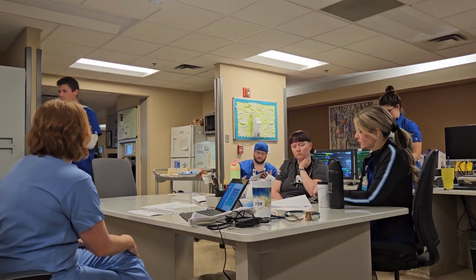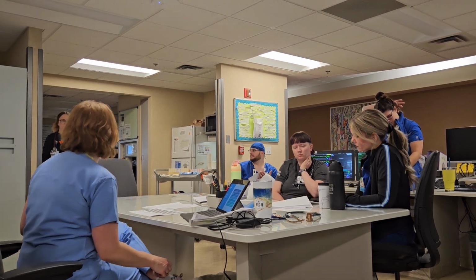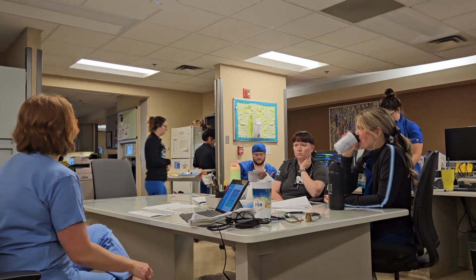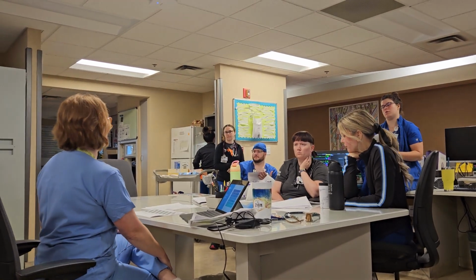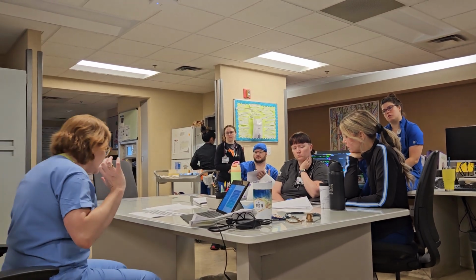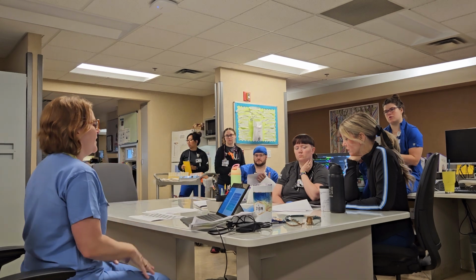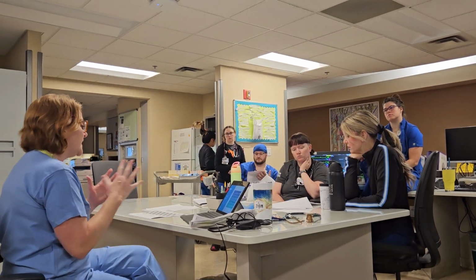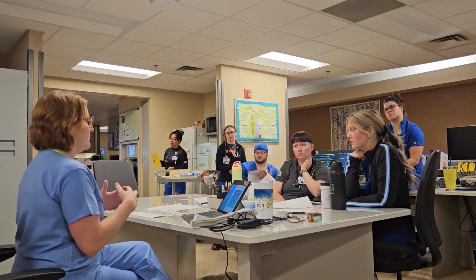Pressure support is neither pressure control nor volume control. It is a spontaneous mode of ventilation. It is the spotter at the gym for people who are trying to wean off the ventilator. It is them doing the initiation and the spotter just saying, ugh, and helping them get that breath in. So the breath volume is controlled entirely by the patient with consideration of the pressure support that we're providing.